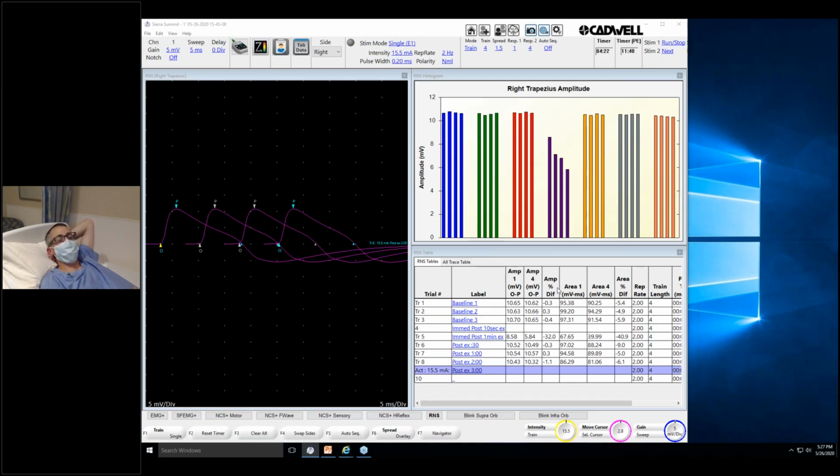In adults, I think the femoral nerve is more difficult because it's harder to stimulate the nerve. In fact, if we do a femoral motor conduction study, then we often will use a monopolar stimulator, or sometimes a monopolar needle to stimulate the nerve. So I think it's a more difficult nerve to perform rep stim on adults. We don't do it a lot on pediatric patients, so it may be a bit easier if they're thin and don't have as much musculature. But yes, and in fact, there's some evidence that the femoral nerve is a better nerve in patients with suspected Lambert-Eaton syndrome.